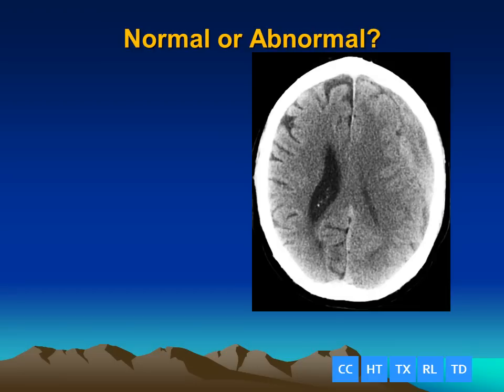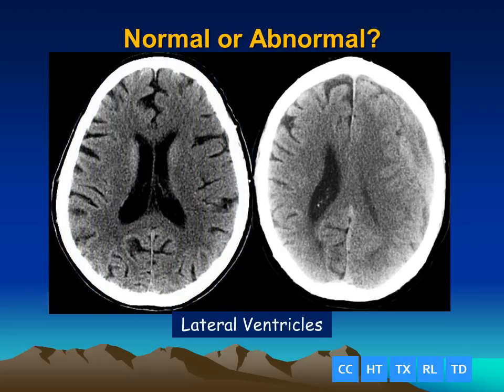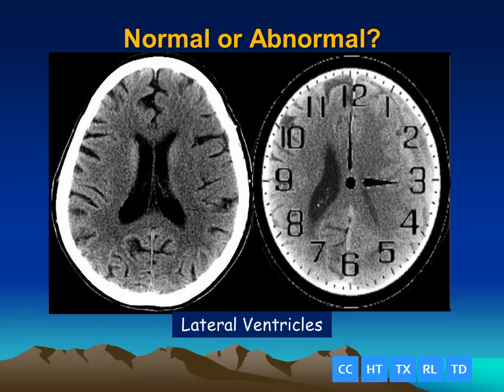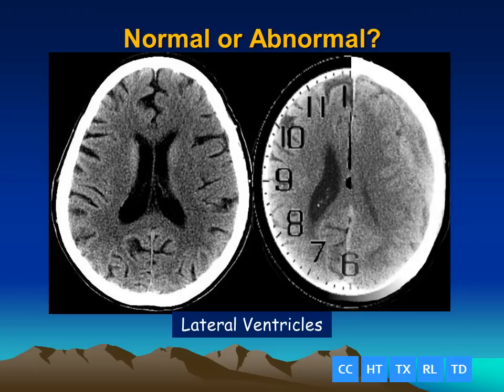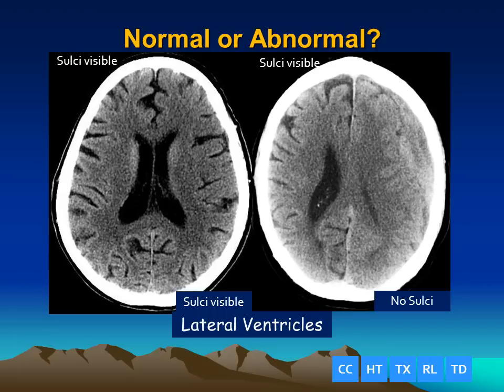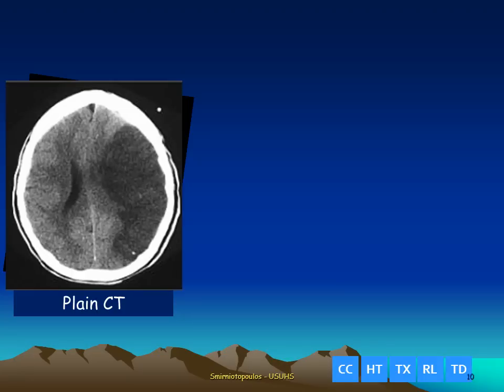How about this case? This is also at the level of the lateral ventricles. If we compare it to the normal side, we can see sulci all the way around on the normal patient. But on the abnormal patient, if you follow the clock face, we have an absence of sulci overlying the patient's left hemisphere. The sulci are invisible and compressed underneath this isodense extraaxial blood clot — an isodense subacute subdural hematoma.